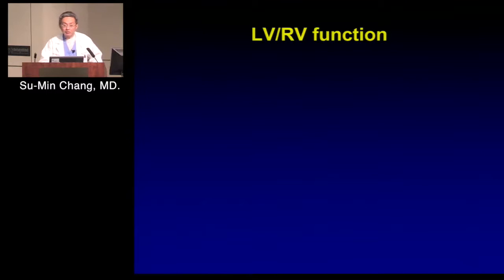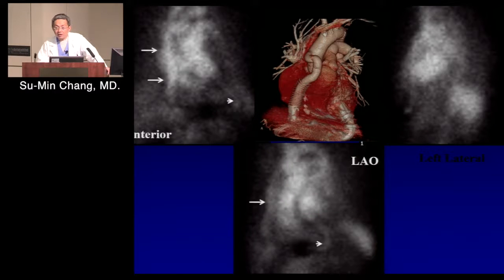occasionally you have a patient with a difficult window. It's hard to evaluate LV function. You want a more objective assessment of ejection fraction for a patient in whom you suspect recovery, or you want a better sense of RV function assessment, which is oftentimes not so easy with echo. And believe it or not, MUGA could be useful. You can do it in a patient with renal insufficiency, as long as the patient can lay flat for a little while and they have a decent window, and you have a tech who knows how to do it. Unfortunately, it's kind of a disappearing art. We do it so few right now that a lot of people don't really know how to do it. But MUGA could be useful.